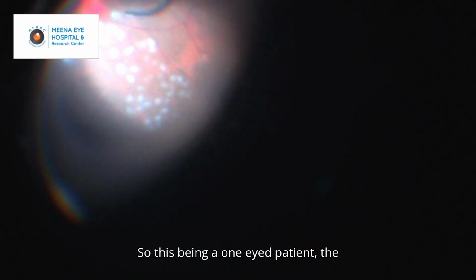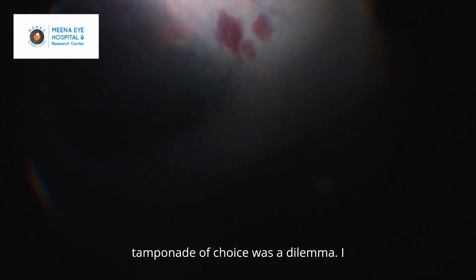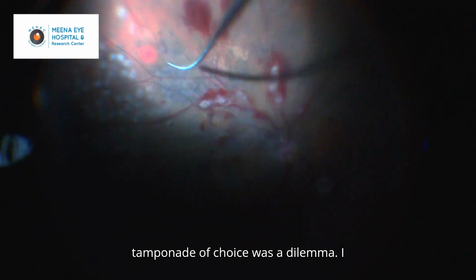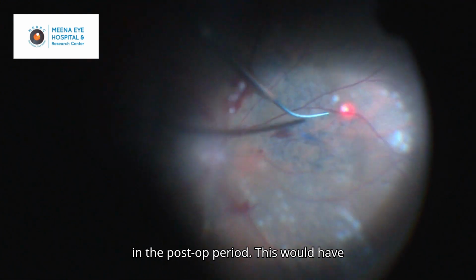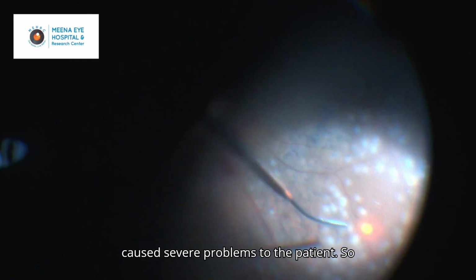So this being a one-eyed patient, the tamponade of choice was a dilemma. I didn't want to keep the patient on gas or air, so I decided to go with silicone oil, as I didn't want any dispersed hemorrhage in the post-op period. This would have caused severe problems to the patient.